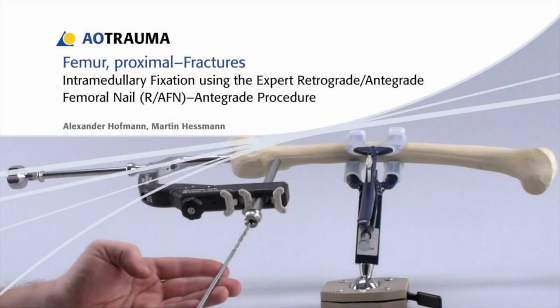In this presentation, the techniques for the intramedullary fixation of a proximal femoral fracture will be demonstrated using the Retrograde Antegrade Femoral Nailing System, or RAFN. Clinically, each step of this minimally invasive procedure is verified under image intensification.